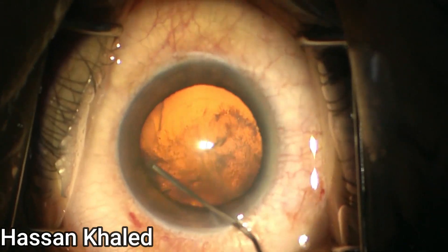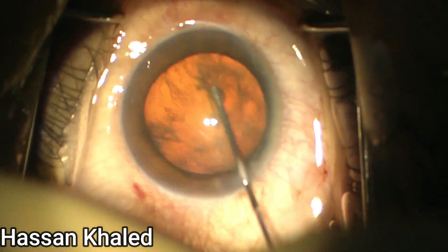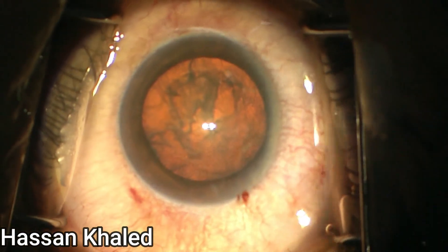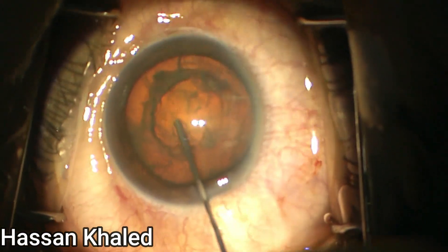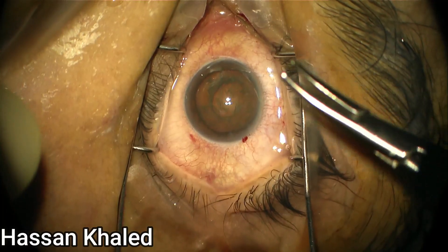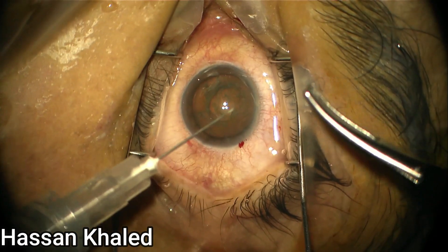Then you can empty the anterior chamber slightly and do hydrodissection. In this technique it is very crucial to obtain a complete hydrodissection, then gentle viscodissection of the superficial cortex.